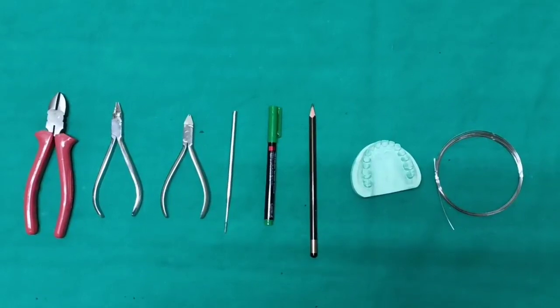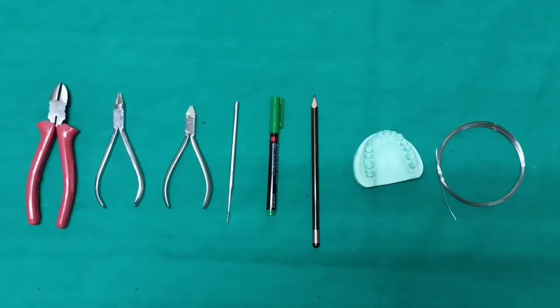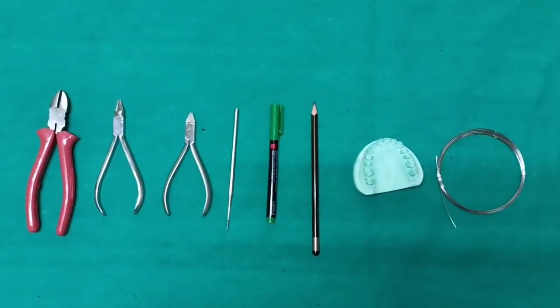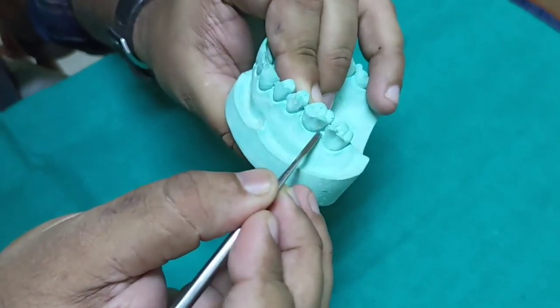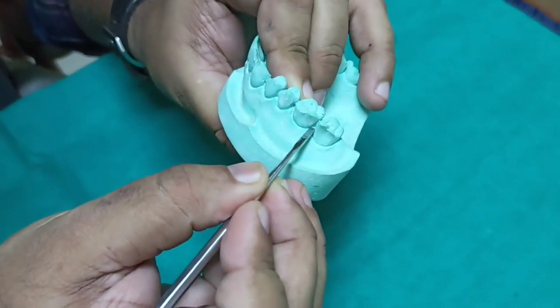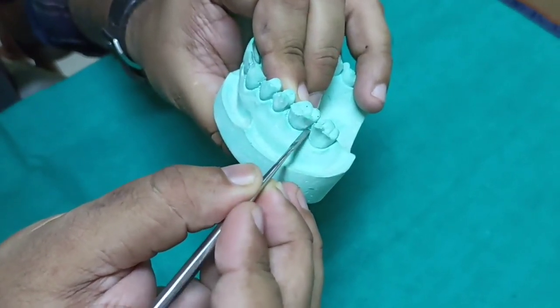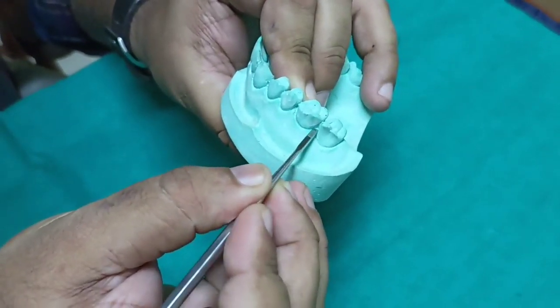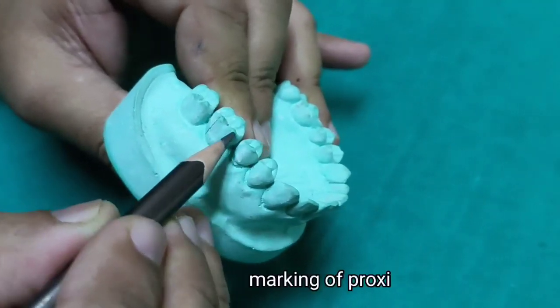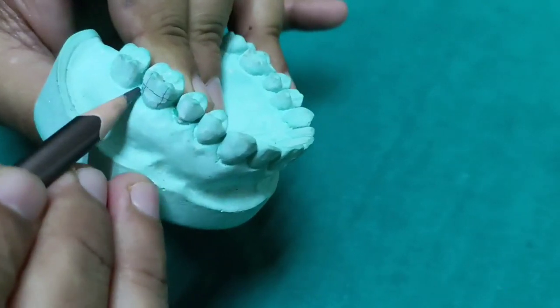Adams plier, Young's universal plier, hard wire cutter, enamel chisel, and marking pencil are the armamentarium required for the fabrication of Adams clasp. In the case of partially erupted teeth, if the proximal undercuts are not visible due to papilla coverage, you should prepare the plaster cast using a sharpened enamel chisel so as to get access to the proximal undercuts. Then the next step is marking of proximal undercuts.